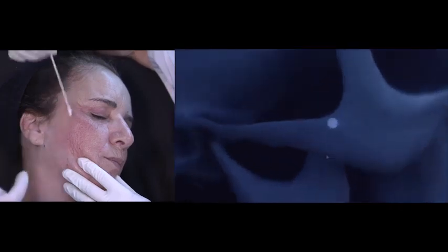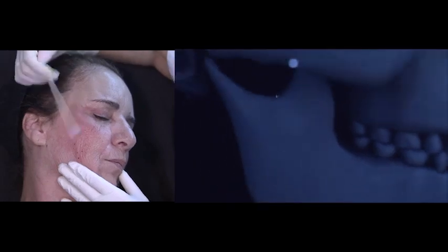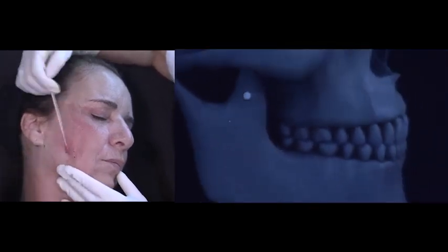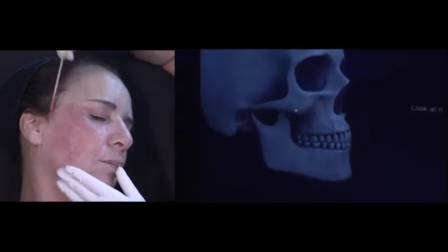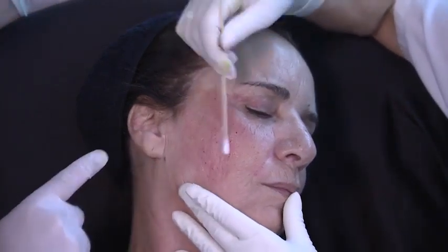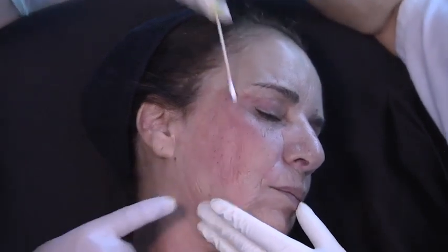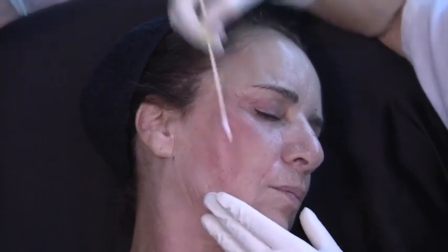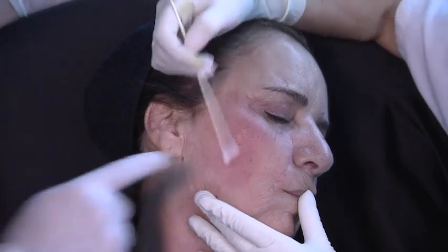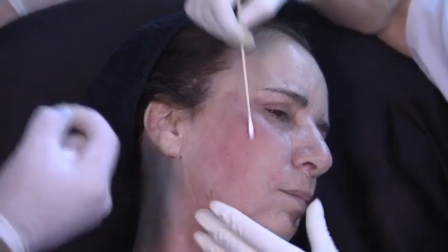Right, so as I said, it will depend on the expectations of the patient. It's always good to improve the quality of the skin first, but sometimes if we do a skin booster, she looks a little bit better, but she expected more. So as soon as we put our hand in the face of our patients, they think they're gonna look like Angelina Jolie, all of them. So it depends on my patient. This is why we need to talk to our patients, and if she is a non-demanding patient, I go for the skin boosters, okay? I go for a fractional laser, okay? I have a CO2 fractional laser and an Nd:YAG laser, both, okay?